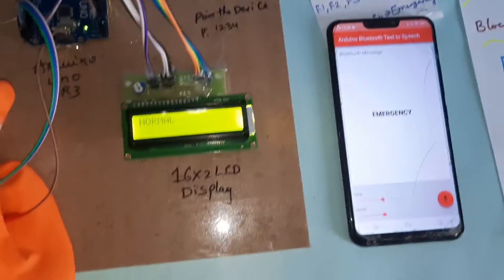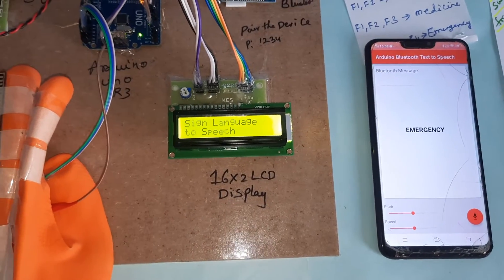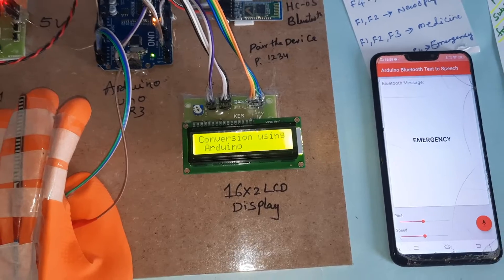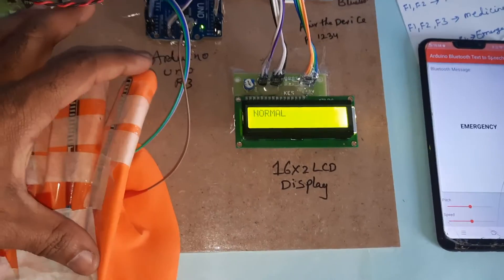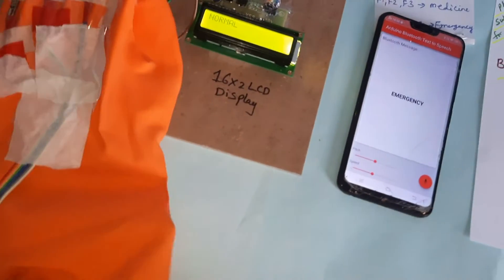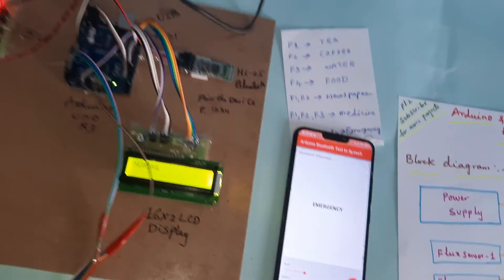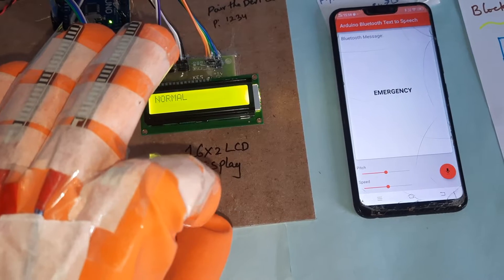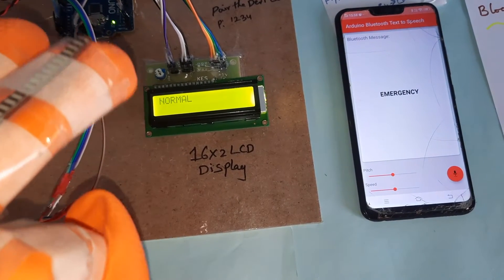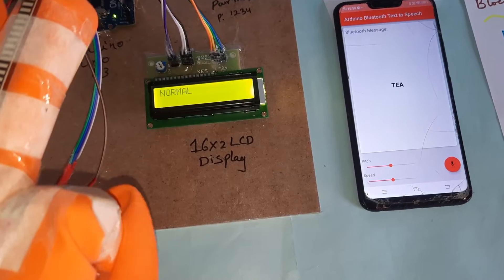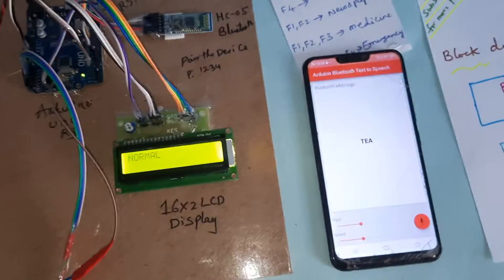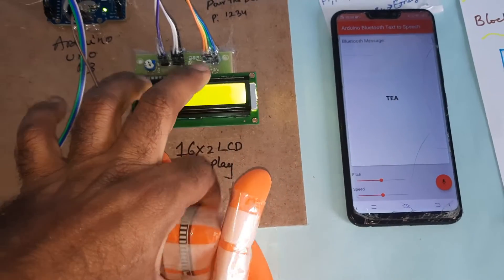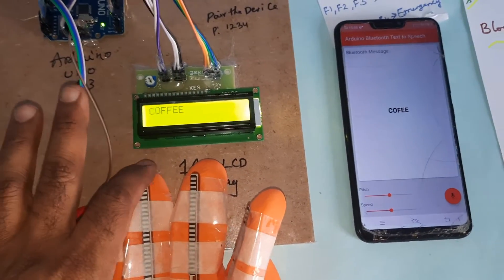Press reset button. Hand gesture to speech conversion using Arduino. Coffee.